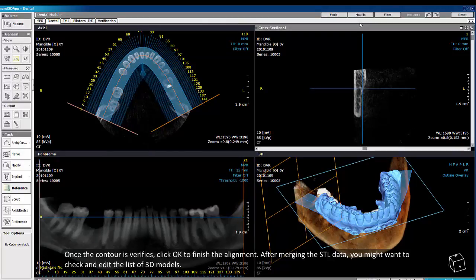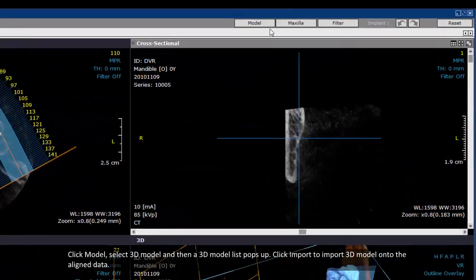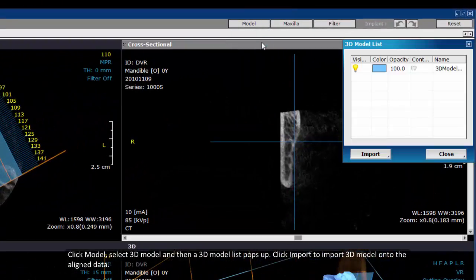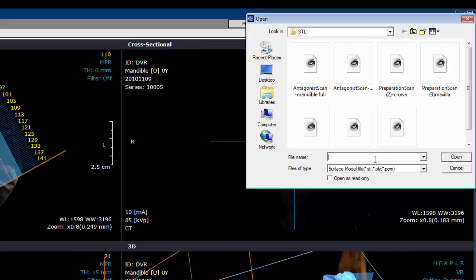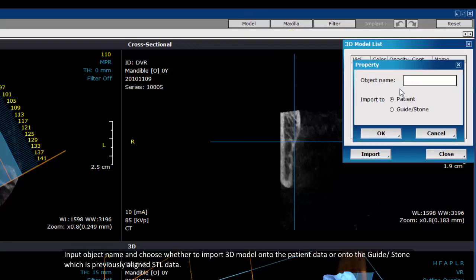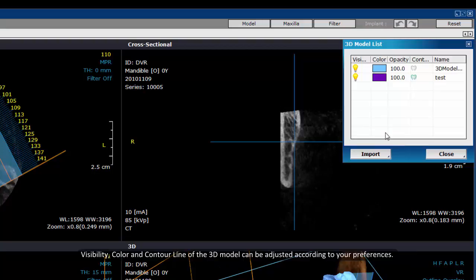After merging the STL data, you might want to check and edit the list of 3D models. Click Model and select 3D Model, and a 3D model list pops up. Click Import to import a 3D model onto the aligned data. Input the object name and choose whether to import the 3D model onto the patient data or onto the guide or stone, which is the previously aligned STL data. Visibility, color, and contour line of the 3D models can be adjusted according to your preference.